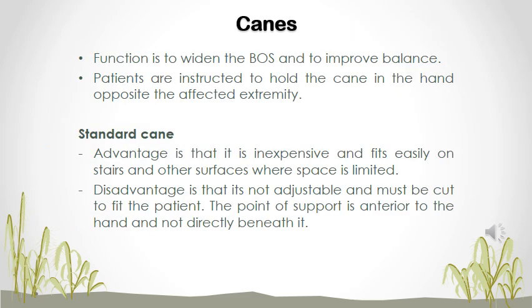From this point on, we're going to go into specifics with the various types of mobility and walking aids. Here we are going to look at canes. So the function of using a cane is to widen the base of support and to help with balance.